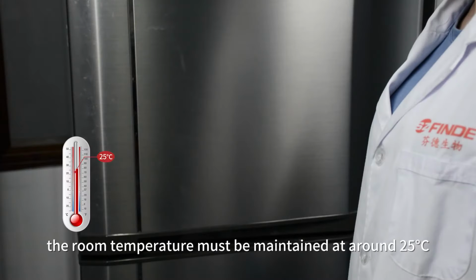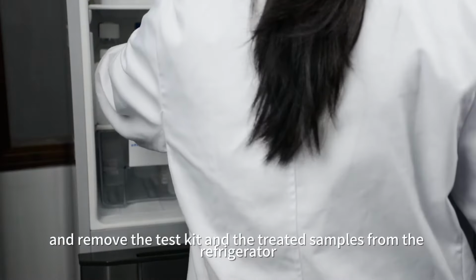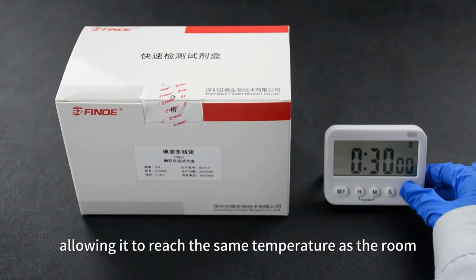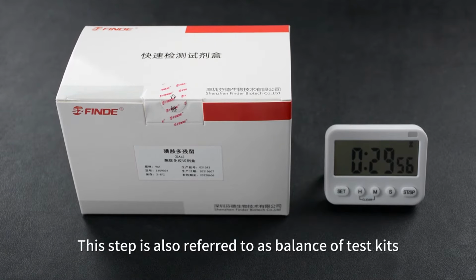Return to room temperature. First, the room temperature must be maintained at around 25 degrees Celsius. Wait for it to stabilize and remove the test kit and the treated samples from the refrigerator. Allow the test kit to sit indoors for 30 minutes or more, allowing it to reach the same temperature as the room. This step is also referred to as balance of test kits.